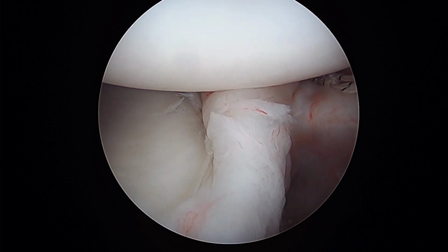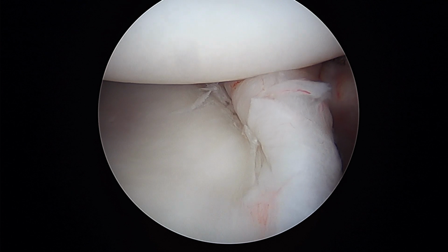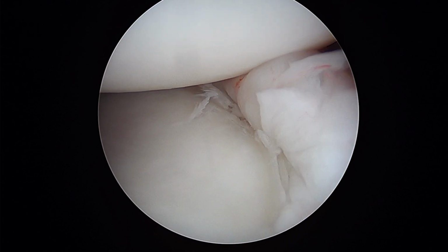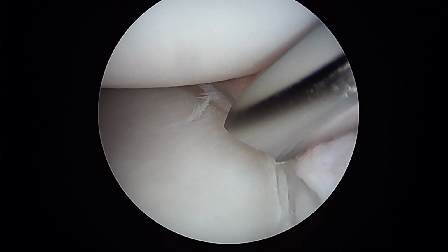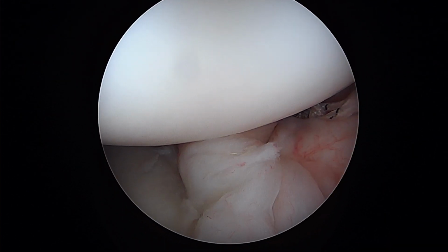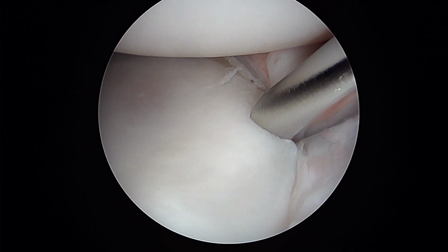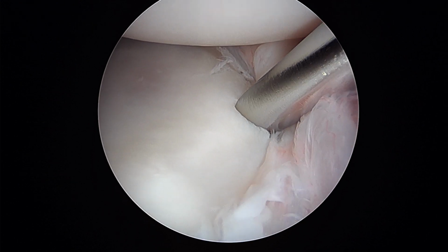So we're going to take that T-handled guide. We're going to place one more suture anchor here. I'll show you where that's going to be located. That's going to come down, and we're going to place this. This is probably going to be the final suture anchor, actually, the way things are looking. And I think we're going to place it right about here. So we'll get this done and show you some more in just a minute.